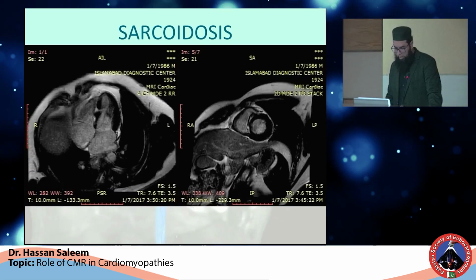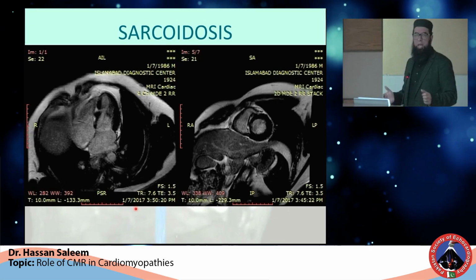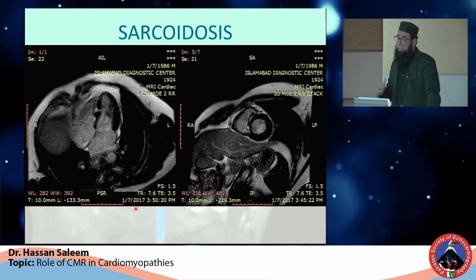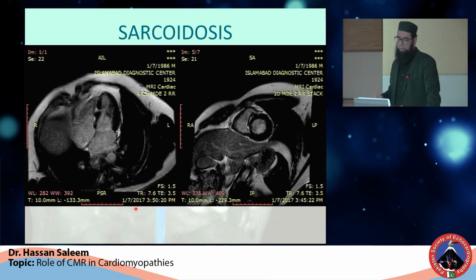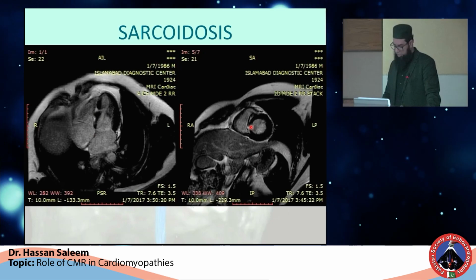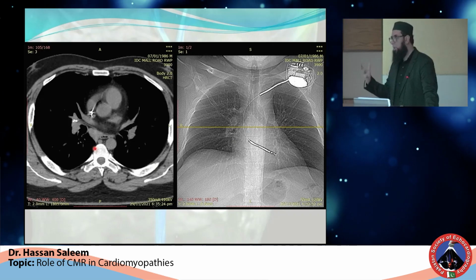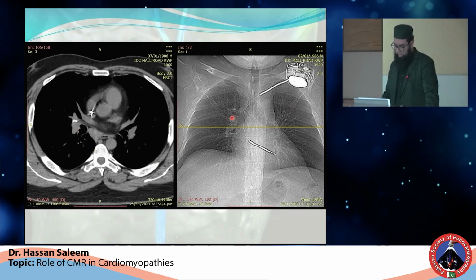That's one of my early cases. I think it was in 2017. Patient had a known sarcoid, went to a medical specialist with arrhythmias, and he suspected sarcoid. And luckily sent this patient for a cardiac MR, and there was an epicardial scar there in the septum, and a straightforward cardiac sarcoid diagnosis was made. Later on, patient had CT at our center. There were large lymph nodes, some of them calcified, and the device was placed.